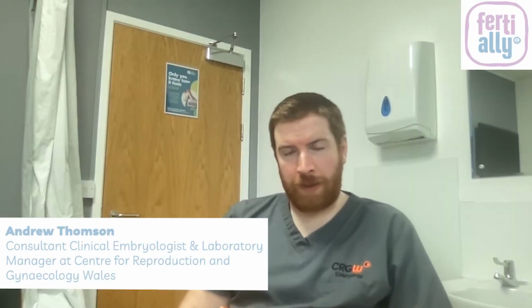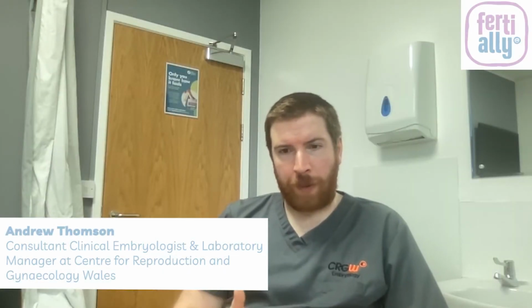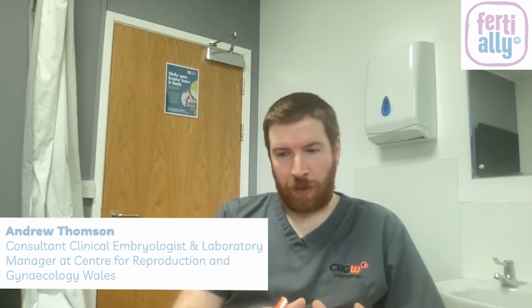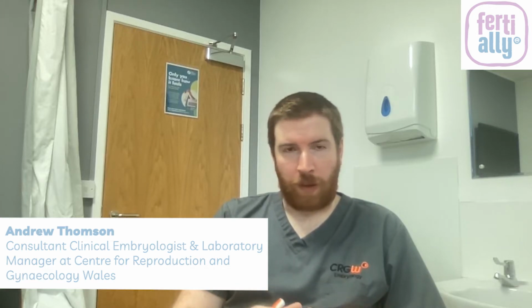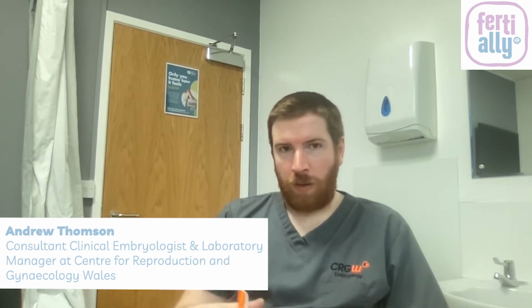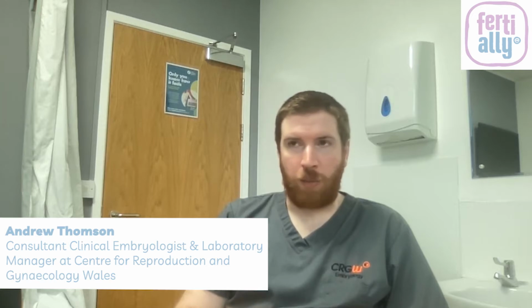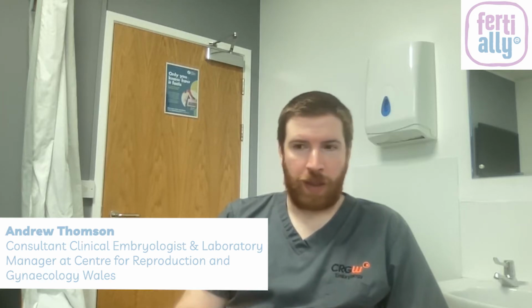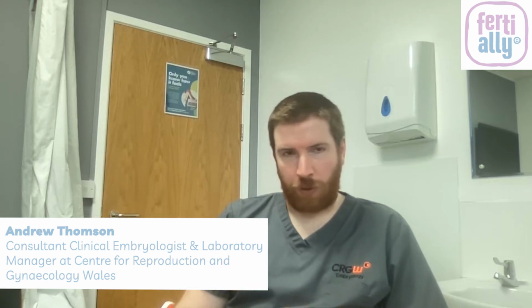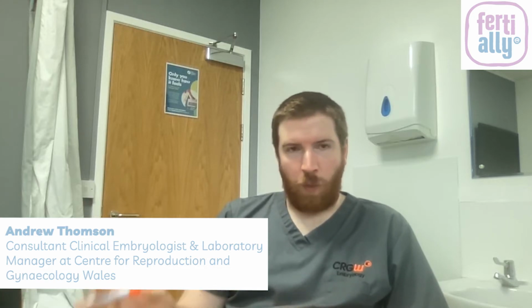Time-lapse technology. So historically, what happened was you would have your egg collection, they would go into an incubator, we'd take them out of the incubator, mix the sperm, we'd check them the next morning, they'd go back in the incubator, you might check them on day 2, you might check them on day 3, you might check them on day 5, and again on day 6. So all you get is little snapshots, and you're having to remove them from their environment to check them.